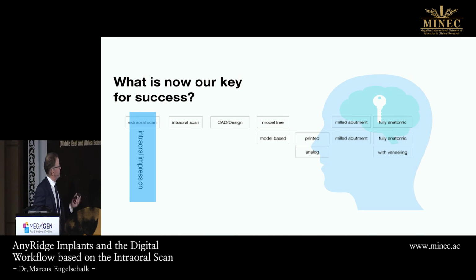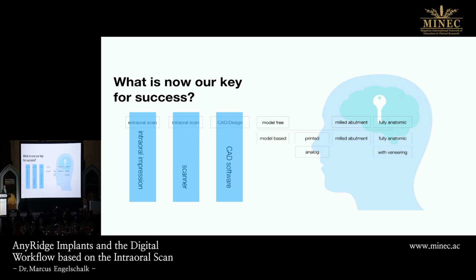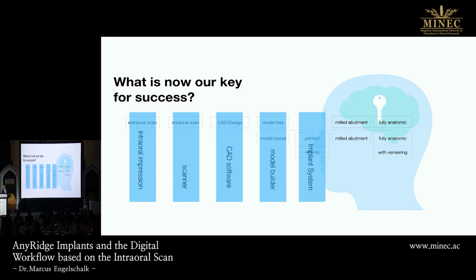The intraoral impression is determining the extraoral scan, but we don't have a look on this. The scanner, the intraoral scanner, is determining a little bit the intraoral scan. The CAD/CAM design is determined by the CAD/CAM software. That's quite logical. If you can do something model-based or model-free, it's determined by the model builder software you're using. Printed abutments in a model or lab analogs or no analogs is depending on your implant system.